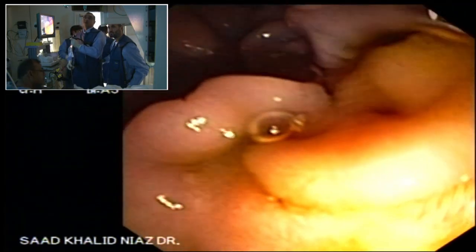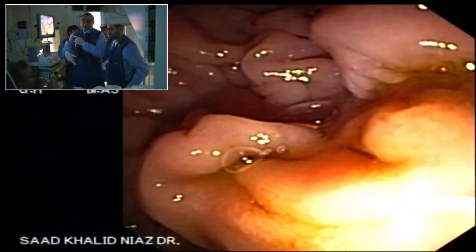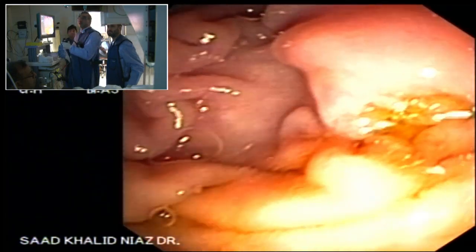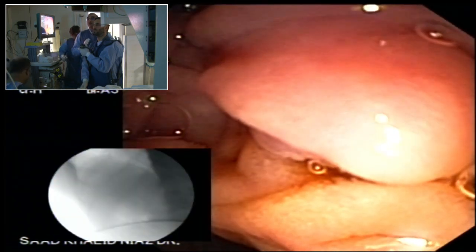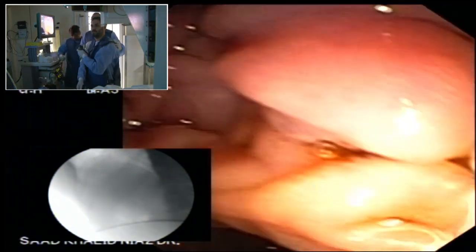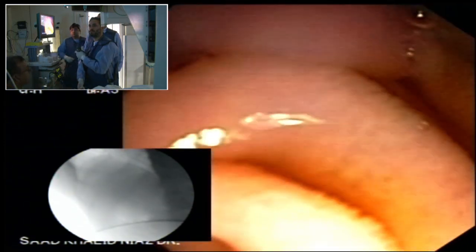Okay. So as we said, the important thing is position, and look at my scope. It is straight. I am holding it up in a comfortable position. It is not twisted or anything, and we are trying to home in on the papilla. Okay, so there you go. Can we see the fluoro image? Right, okay. So now get yourself into position. Stop unnecessary suctioning, and check your position of the papilla. You can turn yourself a bit right, do some movements up and down, see what you can do with the papilla. Yeah, that's right. Okay, good, right.